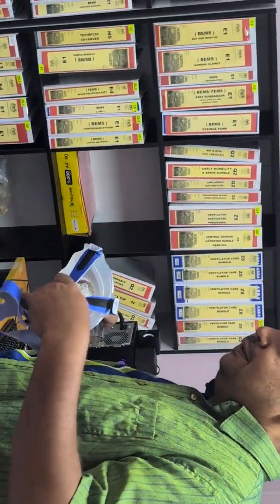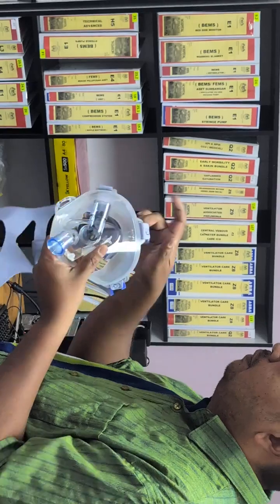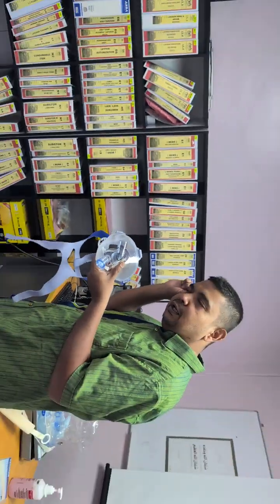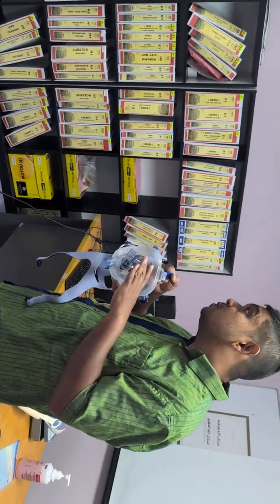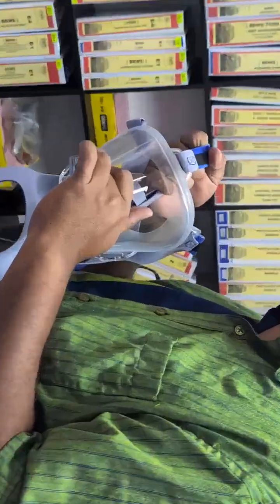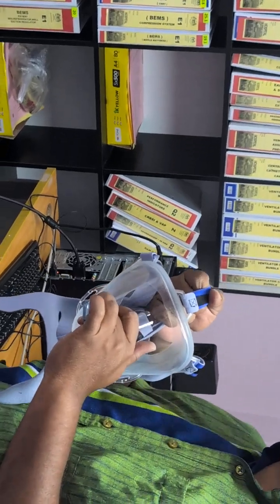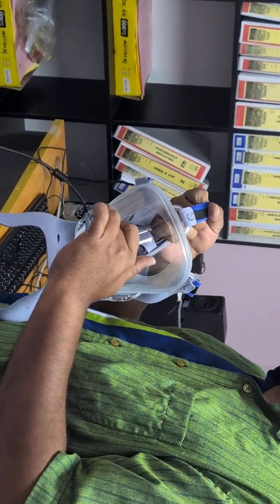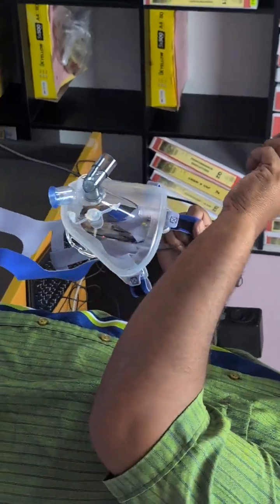Now, there are studies that say the fifth strap, which is right here, is patented, and this company is the only company in the world that has it. It reduces the movement, hence reduces the leak, hence increases the therapy success. Okay, I told you all the advantages, right? I'll tell you the disadvantage now.